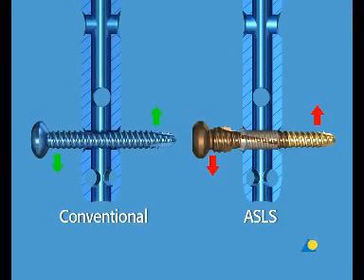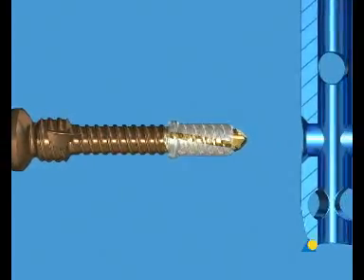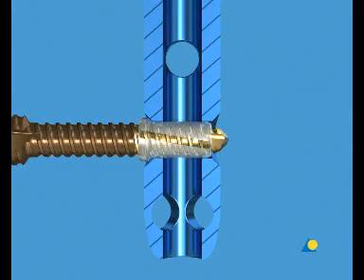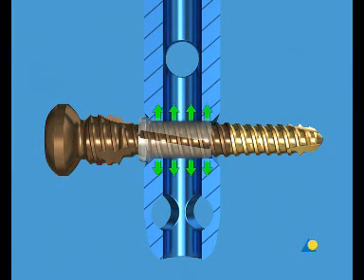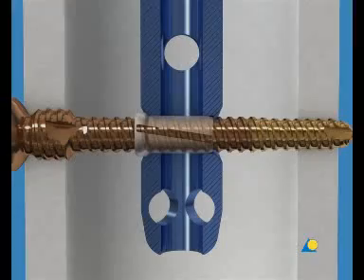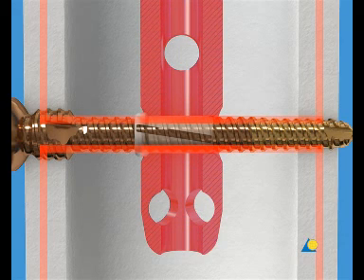The use of the Angular Stable Locking System, or ASLS, produces an angular stable construct between an intramedullary nail and a locking screw, and prevents toggling — this is the concept of the intramedullary fixator. A bioresorbable sleeve is mounted onto the golden tip of the ASLS locking screw. During screw insertion, this sleeve expands as a result of the increasing screw diameter, and locks the screw in an angular stable way in the nail. The ASLS, together with the intramedullary nail, is stably anchored in the bone. Forces are evenly transferred from the cortex through the locking screw to the nail. This force distribution is comparable to the internal fixator when a plate is locked with angular stability.